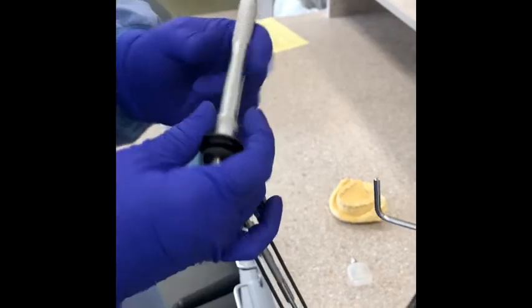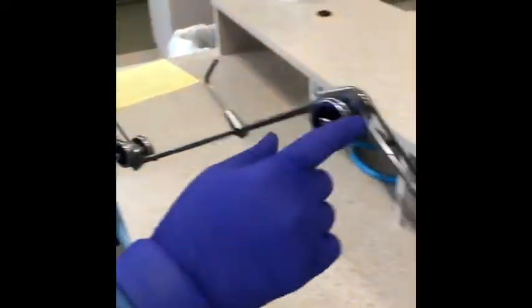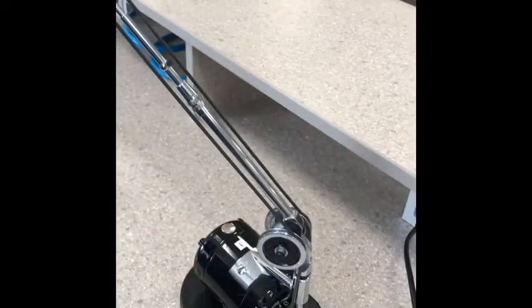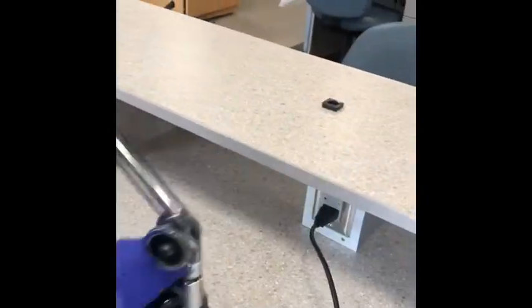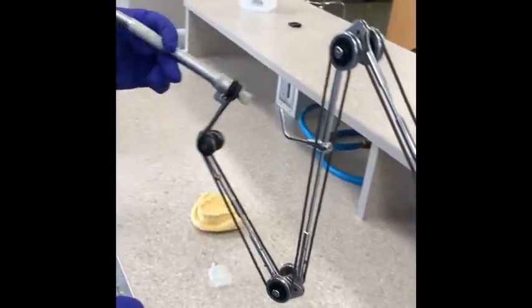into the handpiece. There is this rope, like I said, and it goes around these little joints on the handpiece itself. So again, you want to make sure it's not going to be against the counter, anything like that. You want to make sure it's free from the cord, the counter, your sleeve, your hair, all those things.